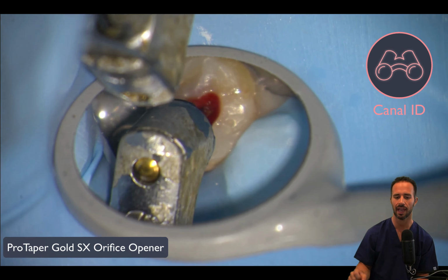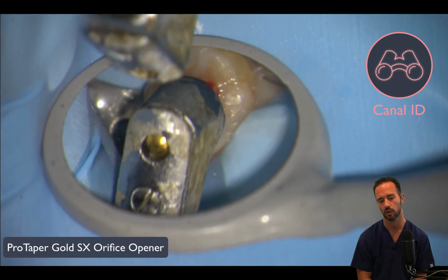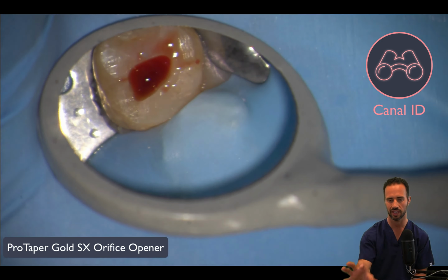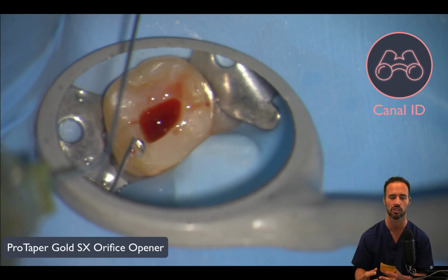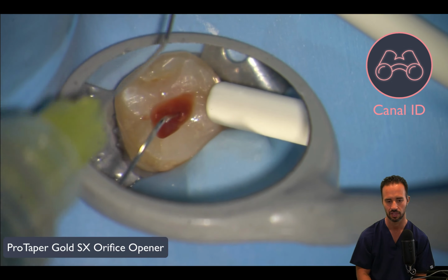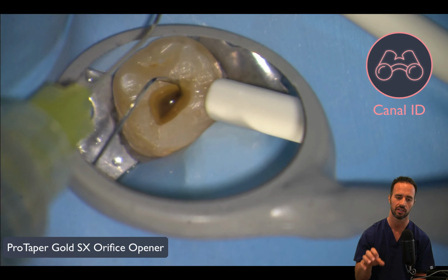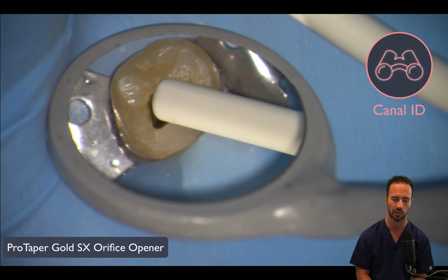And now we're taking our ProTaper Gold SX rotary file, and we're going to be introducing it into the canals. I like to take care of the canals that are bleeding the most first, so we can get some of that pulp tissue out and be able to better visualize what's going on internally. In this case, that's the palatal canal. So I'm passing a lot of sodium hypochlorite inside the tooth here to try to get a lot of that pulp tissue dissolved away so we can continue to orient ourselves internally.